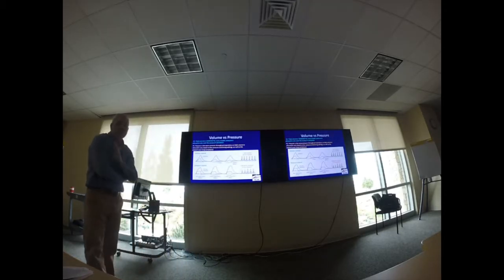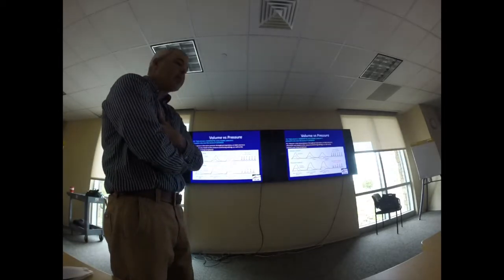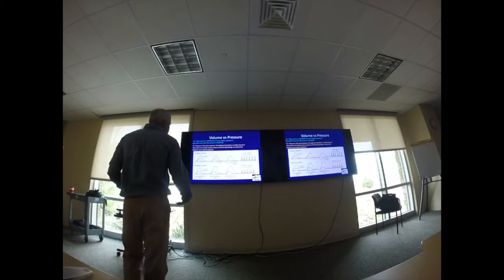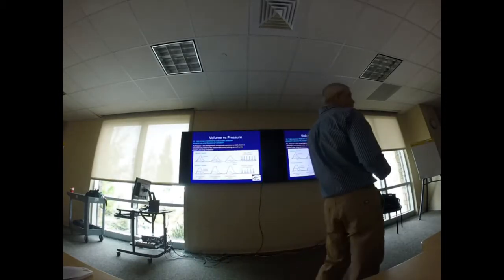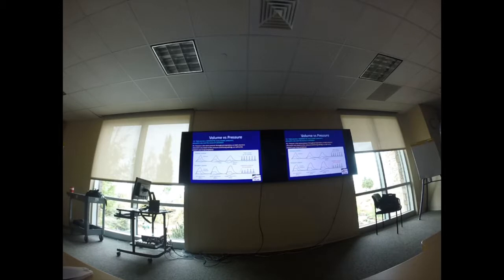And I'll show you guys how to check that. And again, in my opinion, it should really be checked on any intubated patient. When we get into troubleshooting and different disease conditions, we'll look at where my peak inspiratory pressure and my P flat will be, and all of those kind of things. So we're not done with it. We'll get back to it here in a little bit.